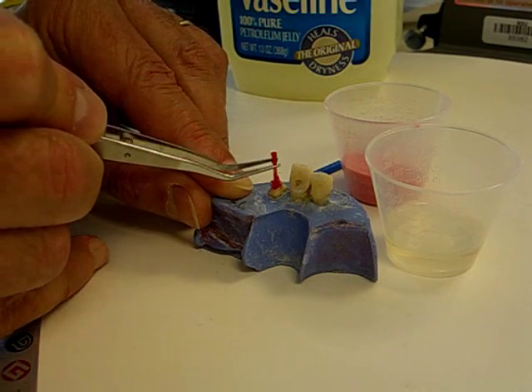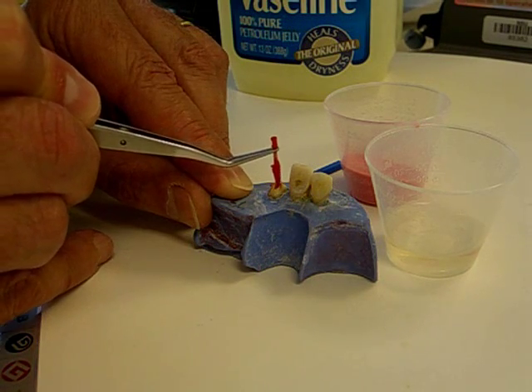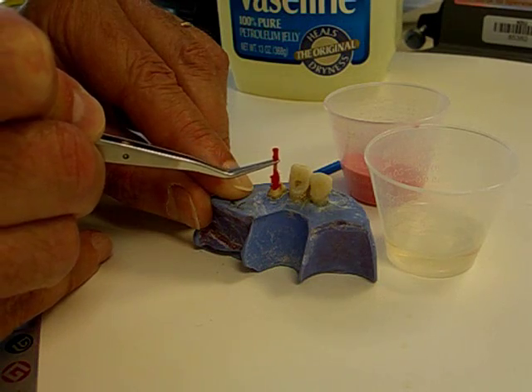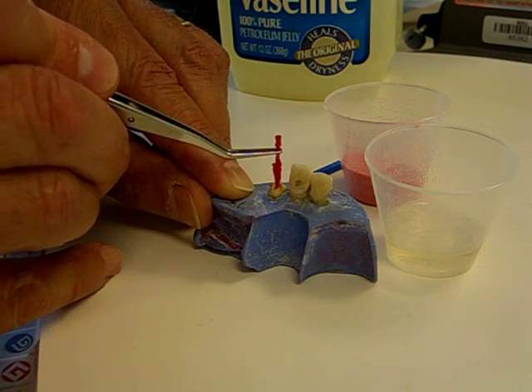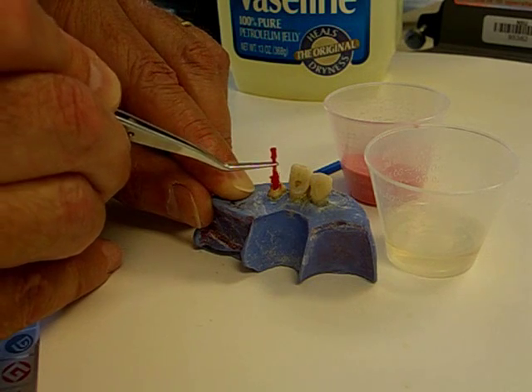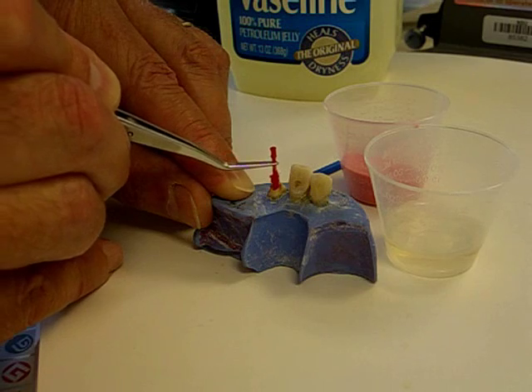I am alternately removing and replacing the sprue pattern. There is some resistance, no doubt because there might be some minor undercuts in this canal space. So to bypass those undercuts, I continue to remove, replace, remove, and replace the GC pattern from the canal.